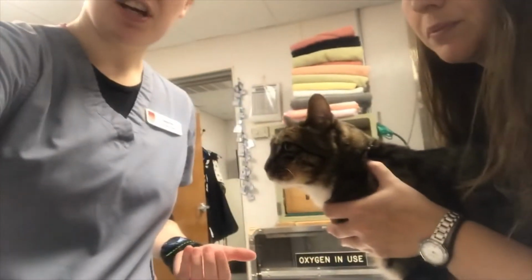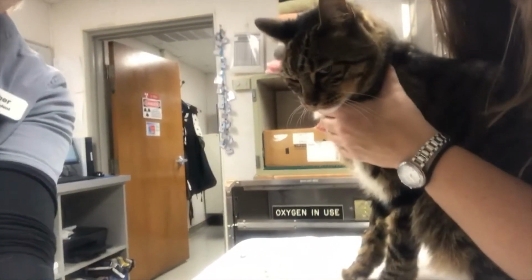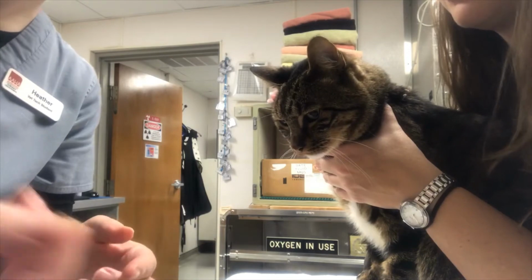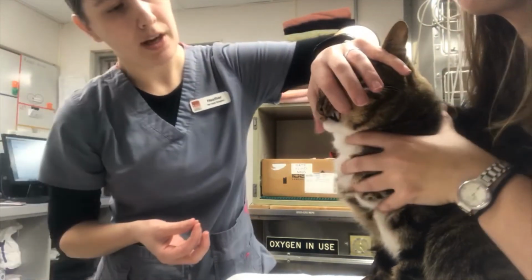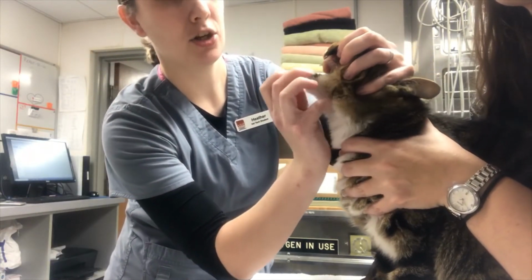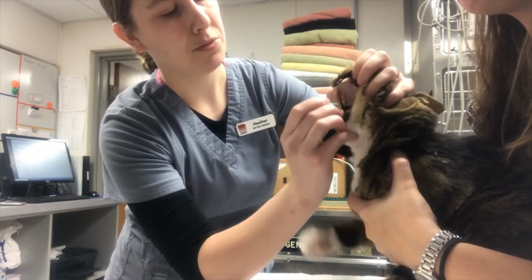I'm going to demonstrate how you would pill a cat. Jake here is not on any medication, so we're just going to use a treat to demonstrate. So for this, I'm going to hold behind his canines and gently lift up. I use my other hand to pull his bottom jaw down.